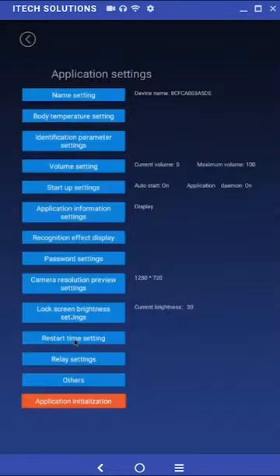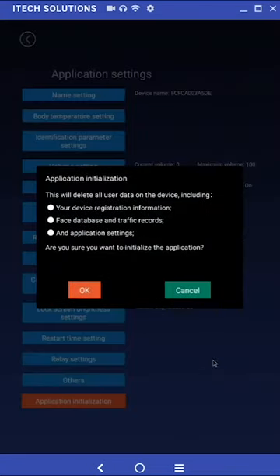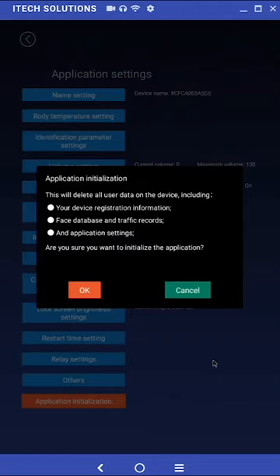Application initialization. Clicking on the setting will give you the option to reinitialize the application. Doing so will delete all user data including the face database and reset all settings back to their default values.